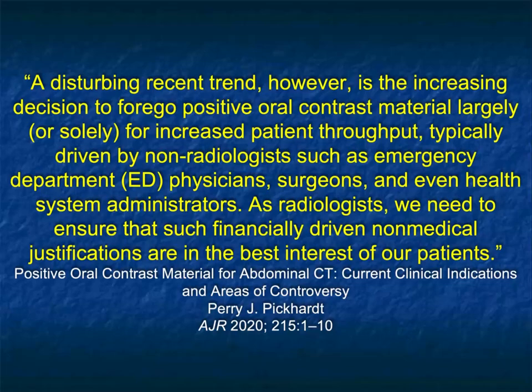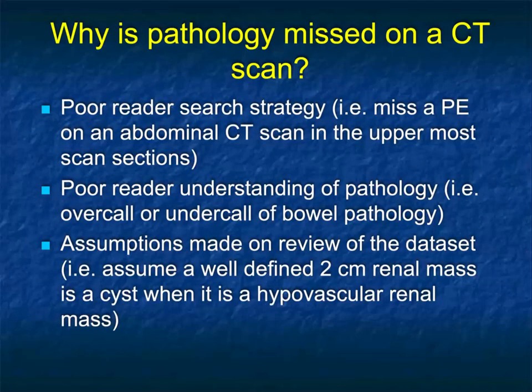Perry does go on to make the point that a disturbing recent trend is the increasing decision to forego positive oral contrast for increased patient throughput, typically driven by non-radiologists such as ED physicians, surgeons, and even health system administrators. As radiologists, we need to ensure that such financially driven non-medical justifications are in the best interest of our patients. Well said, Perry. So then, let's go back to the comment I made about looking at specific diagnosis.